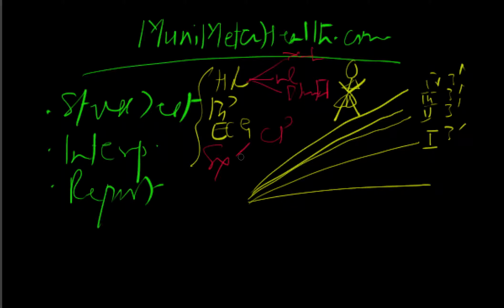You certainly want to elicit those symptoms the patient presented originally for. Is there any shortness of breath? You need to see significant shortness of breath. Most people will get short of breath when they walk or run after 6-9 minutes, so that's expected. But if it is unusual shortness of breath that occurs, say stage 1, and the person is now really making big efforts to take deep breaths, etc., then you know that this person is more moderately or severely short of breath and you've got to stop the test.